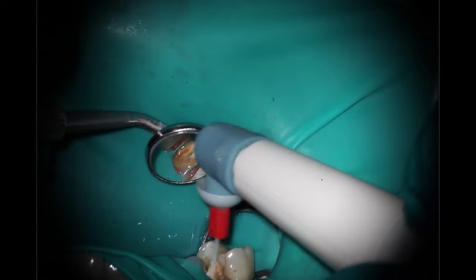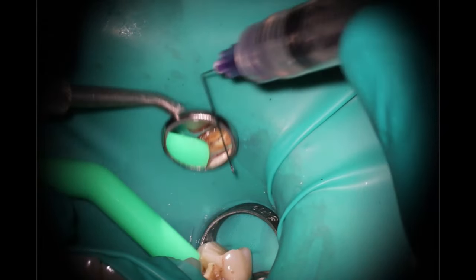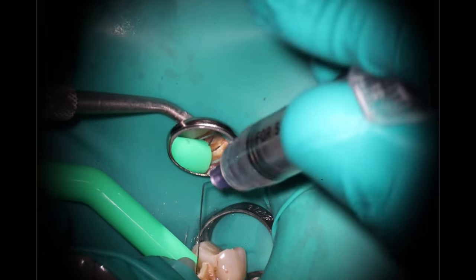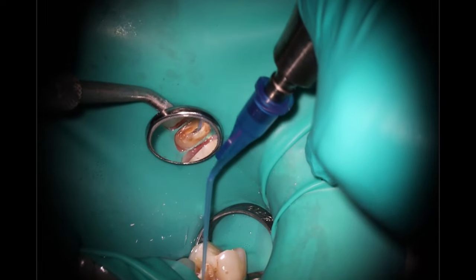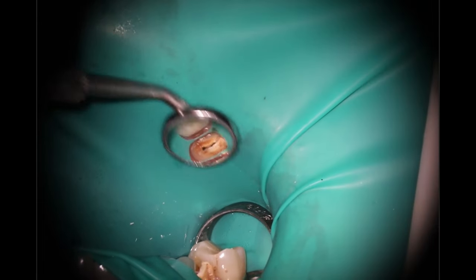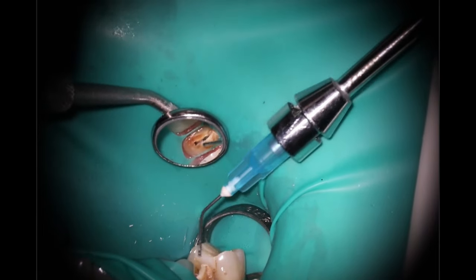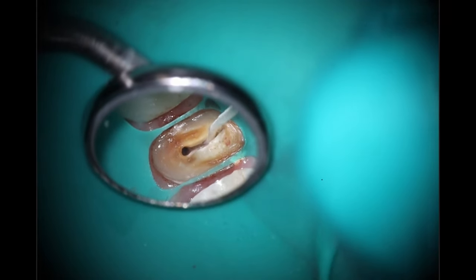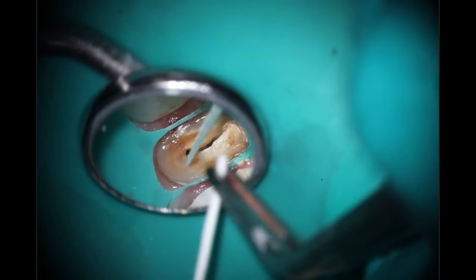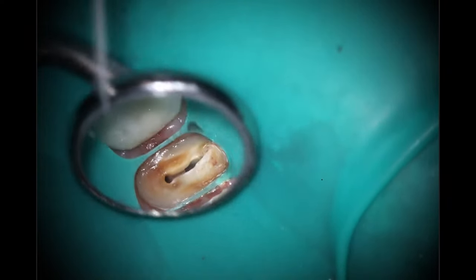I still like using that activator to knock any bits loose. Going back in, I save about half a CC of solution to rinse out — you can also use EDTA, isopropyl alcohol; there are lots of options to clean this out. Using a little micro suction here to get the tooth nice and dry. Then going back in with the air-only Stropko — low PSI, you don't want to blow it out the end of the root. My assistant and I use different size tips; I like the edge tips for more fine work.